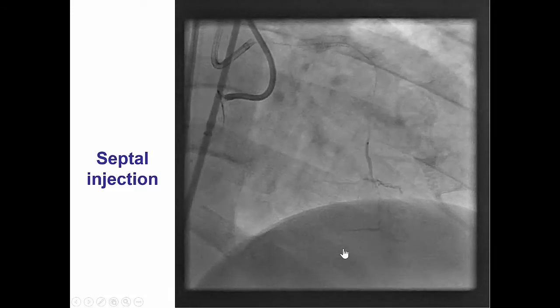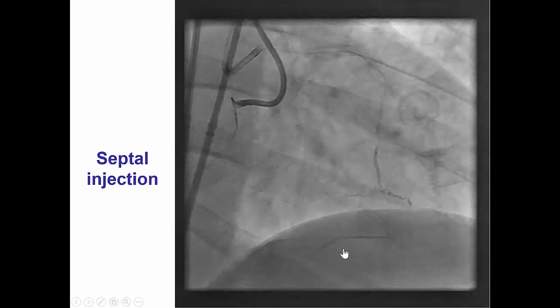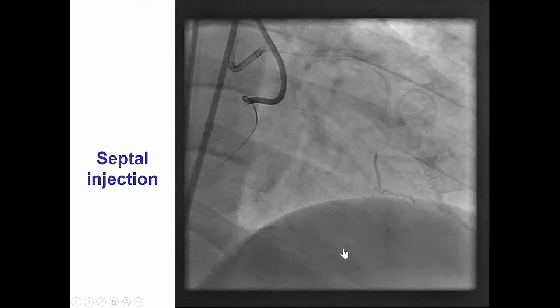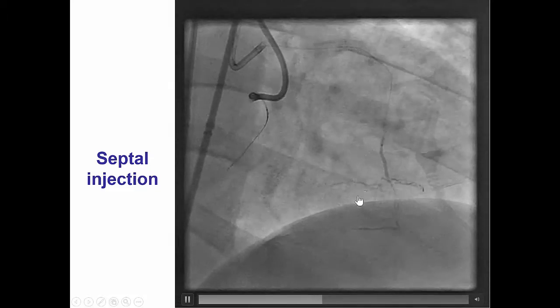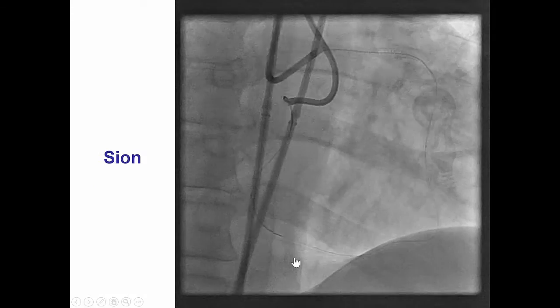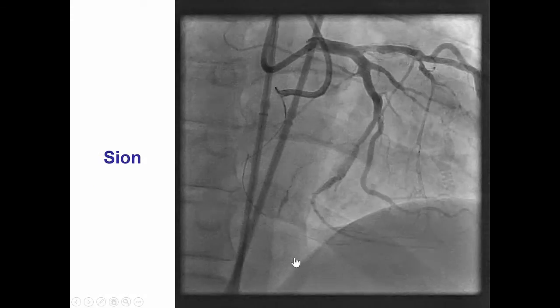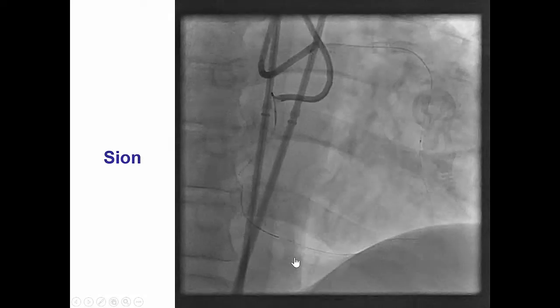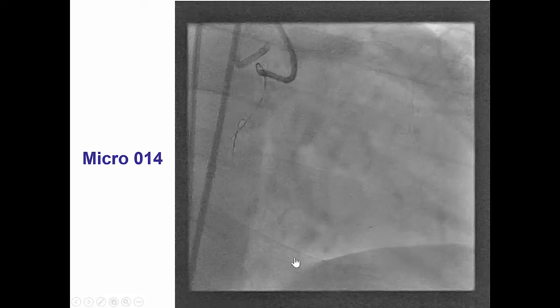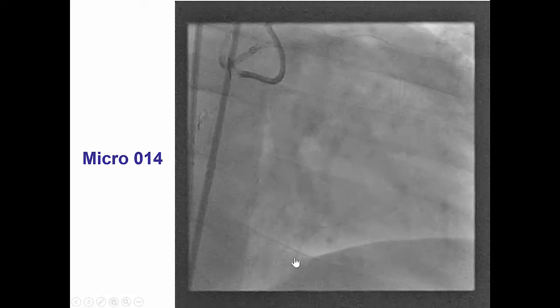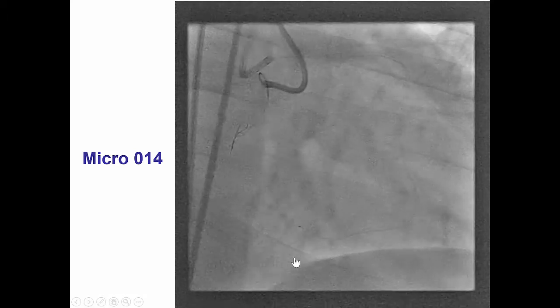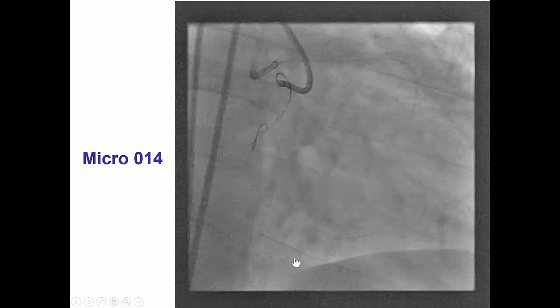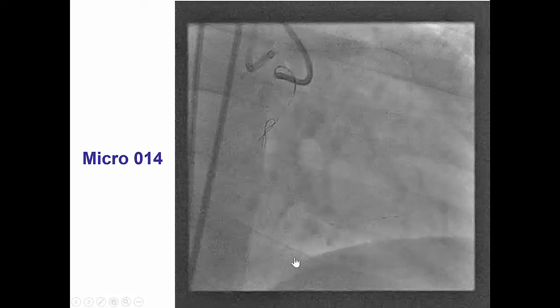We advanced the microcatheter into the septal. The collaterals were not the best; however, we could see a pathway from the septal all the way to the posterior descending artery. We were then able to advance a C-ion guide wire through the occlusion, followed by a micro-14 microcatheter advanced essentially all the way to the distal cap, which was actually much further along than we thought.